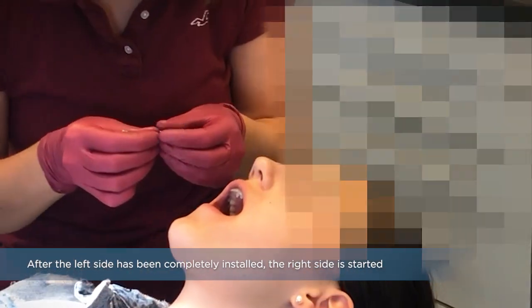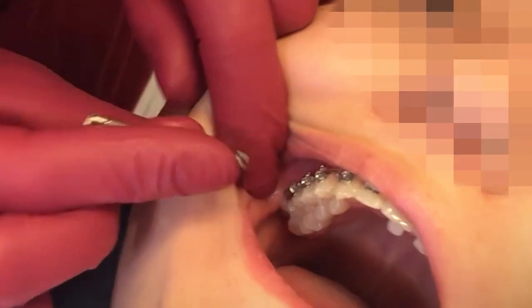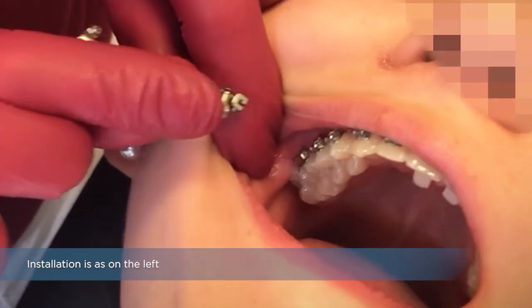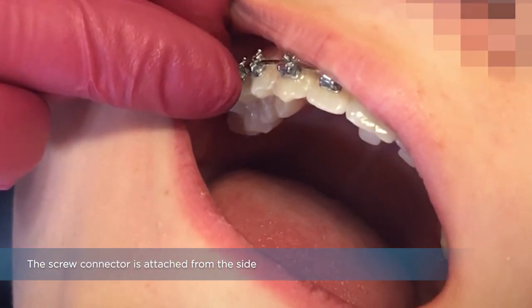After the left side has been completely installed, the right side is started. Installation is as on the left. The screw connector is attached from the side.